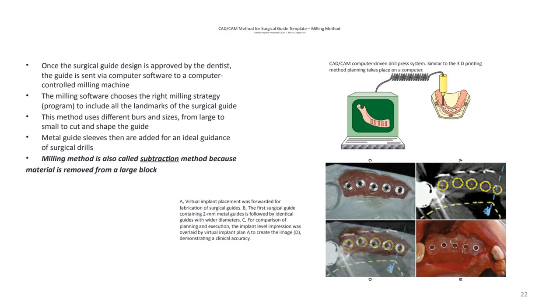So when we're using the CAD/CAM method, we also have different options in terms of fabrication. We can 3D print them, or mill them, okay? And that depends on what we choose to do based on the equipment that we have in the laboratory.